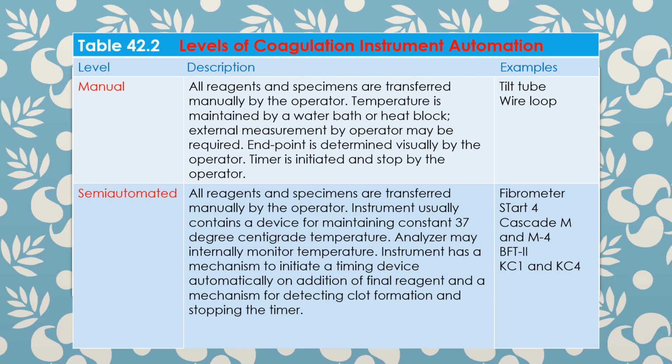The instrument has a mechanism to initiate a timing device automatically on addition of the final reagent, and a mechanism for detecting clot formation and stopping the timer, unlike the manual, which is operated by the operator.